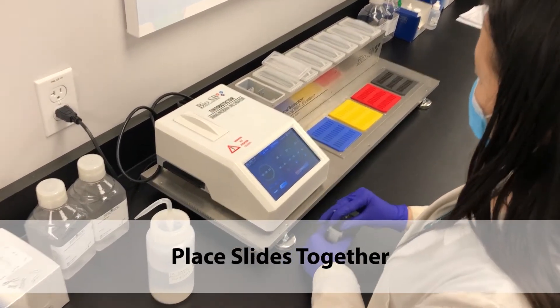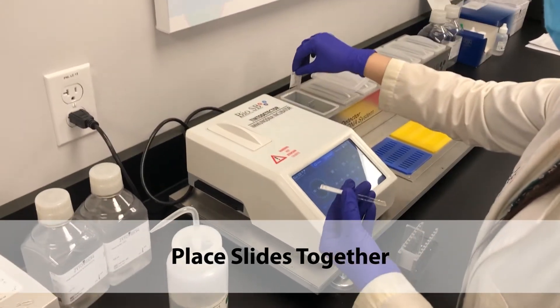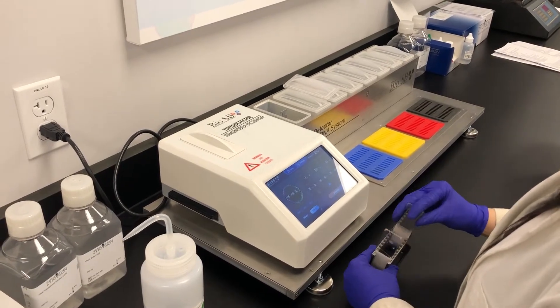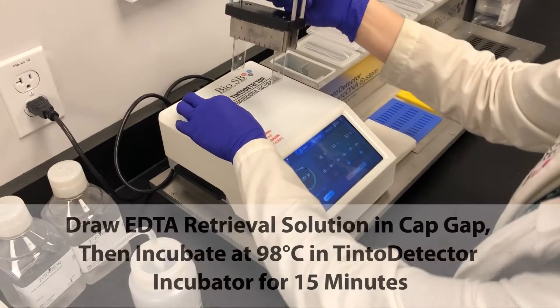When the incubator is at temperature, you are ready to start. Pair the slides face-to-face in the capillary gap slide handle. Draw EDTA solution into the slides and incubate at 98 degrees Celsius for 15 minutes.